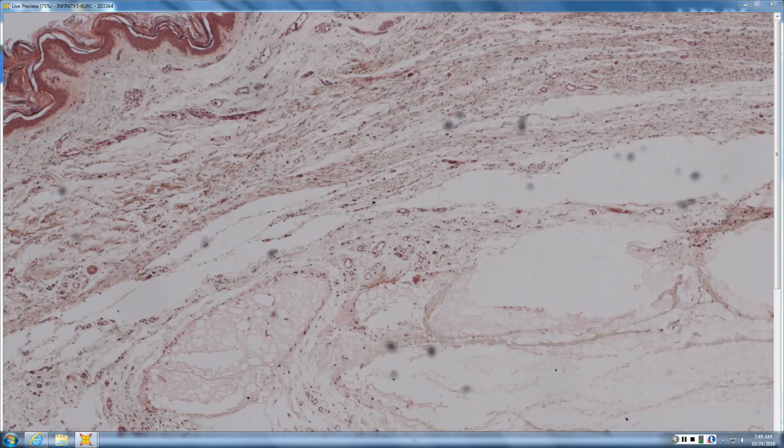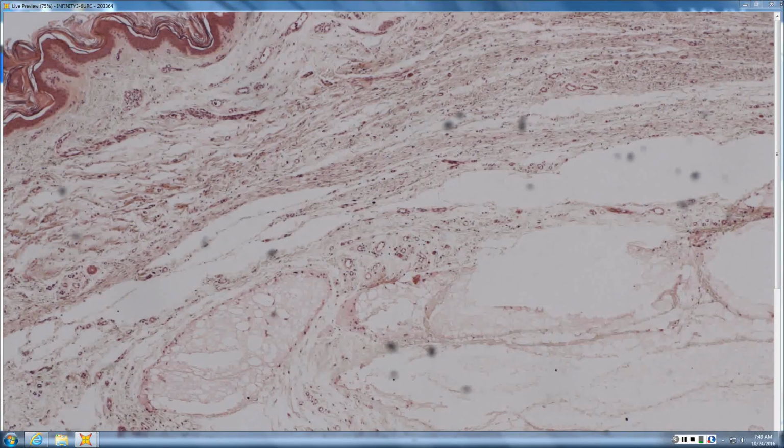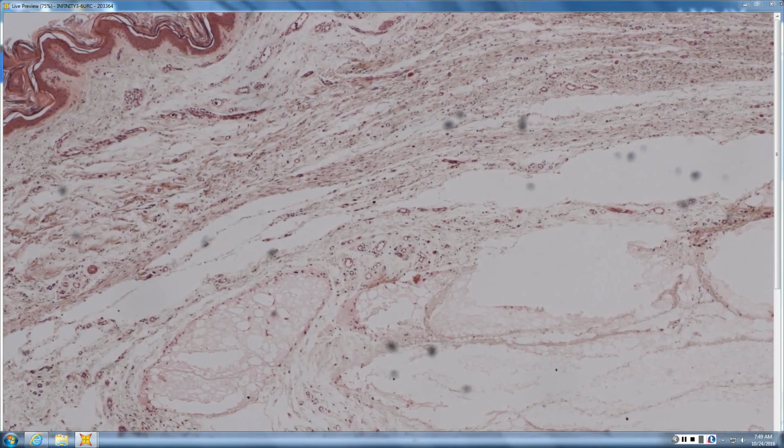You could see this with various injectable fillers, which tend not to produce granulomas but tend to look more mucinous. This is actually what injected triamcinolone looks like. One of the hints is that triamcinolone is actively anti-inflammatory, which is why, despite a whole lot of foreign body in there, you're not making much of a granuloma. Self-cleaning, just like soap. So that was a little triamcinolone.